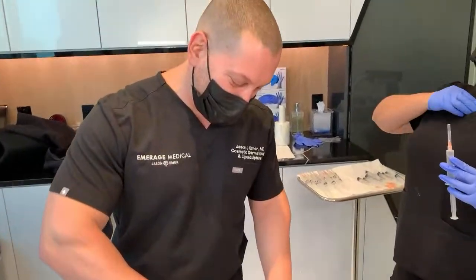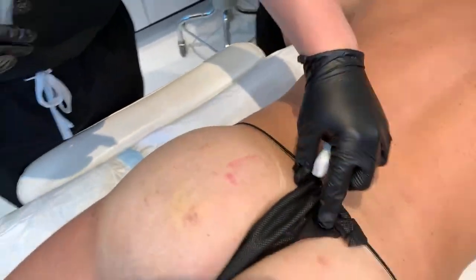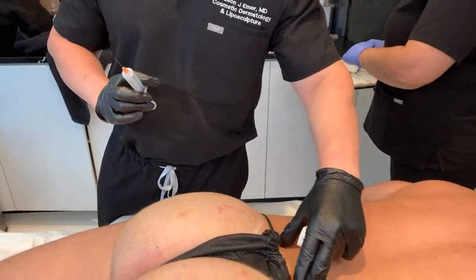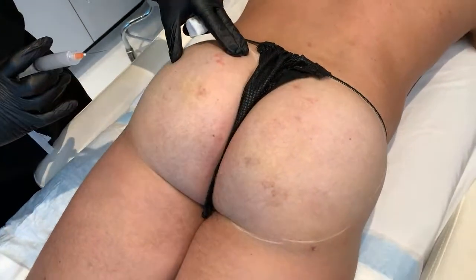Dr. Emer, and we are now doing the peachy soccer butt boost, which is what we're going to call it, because he already has an amazing buttock. We're post fat grafting, and what we're doing now is to get him more contour. It's still really healing. You can't even see yet the dimples in the back or the hourglass curve that we talk about. Squeeze in as hard as you can. You can see, relax, nice lifting.